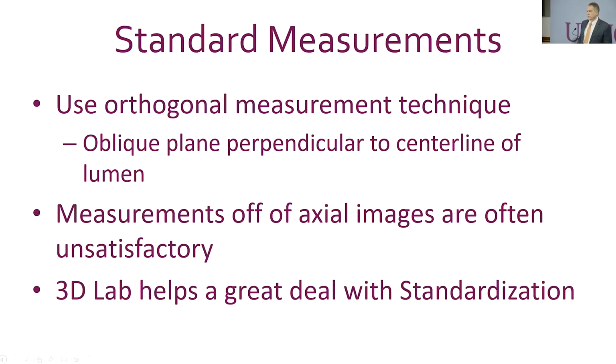So a couple notes about standardized measurements. You always want to use orthogonal measurement technique. Oblique, double oblique reformats and thin multi-plane reformats are the standard. Generally, some PACS systems have this integrated, or you can get 3D post-processing packages that have that capability. Measurements off of axial images are often unsatisfactory and misleading and not reproducible.